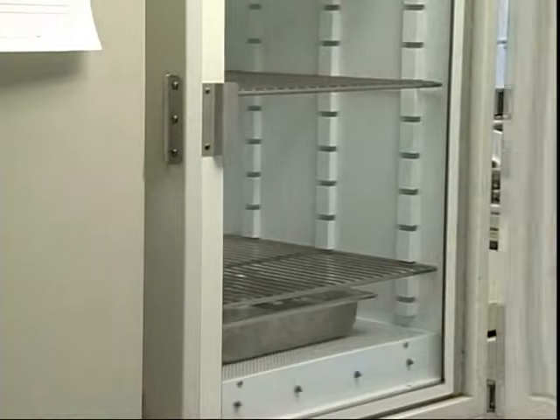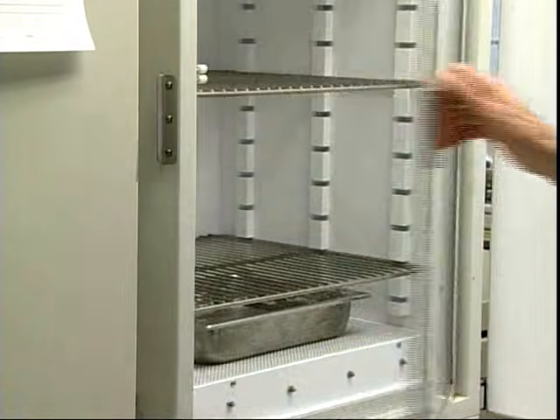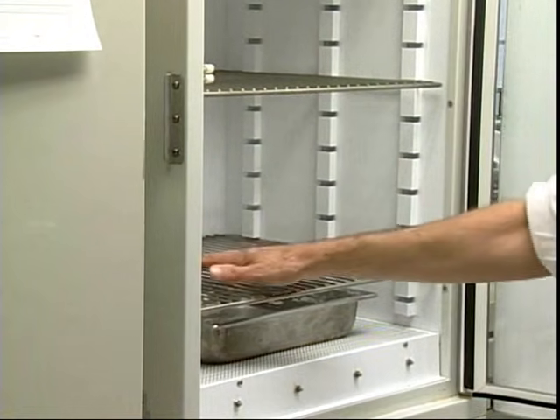We also have a 30-degree incubator, which is used specifically for yeasts. It's a little bit cooler, and some yeasts prefer 30 degrees to grow. So with this 30-degree incubator, the 42 and the 37, we can meet all the temperature requirements of any bacteria that might cause infection in your patients.